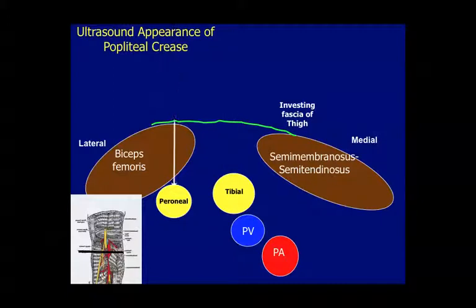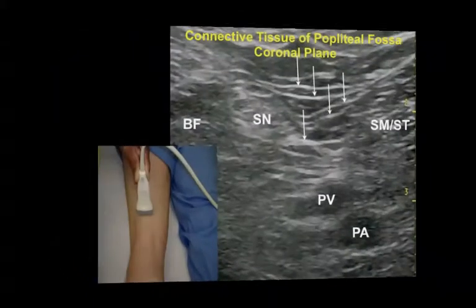Traditional methods suggest that we approach the needle in immediate proximity to the nerve, which again may result in a painful paresthesia at best. By contrast, with the fenestrated needle, we can advance the needle between the two nerves and maintain a safe distance between the tip and both of the nerves, yet deliver local anesthetic in the tissue planes which lie in a coronal fashion between the two nerves.